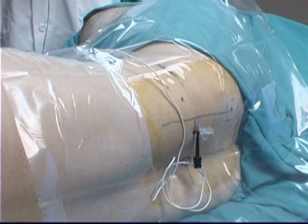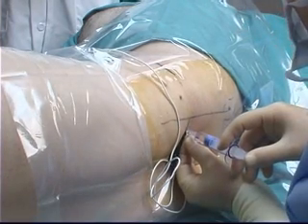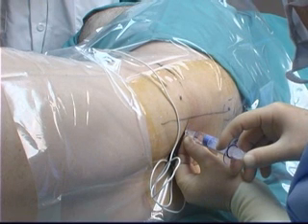The needle stylet is removed when contact with the bone is established. It is planned to walk off the bone in an inferolateral direction, as is indicated here. A loss of resistance to air syringe is attached to the needle, and the needle tip is walked off the bone in an inferolateral direction. If the needle is too short, a 15-centimeter insulated Tuohy needle can be used.